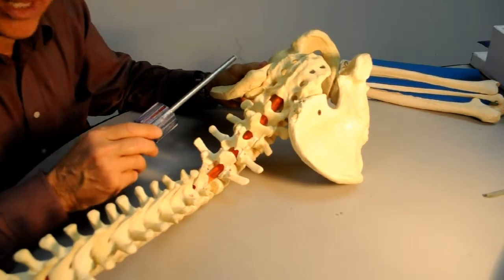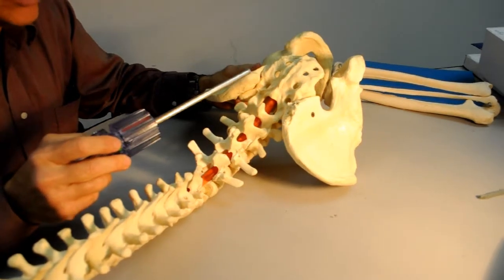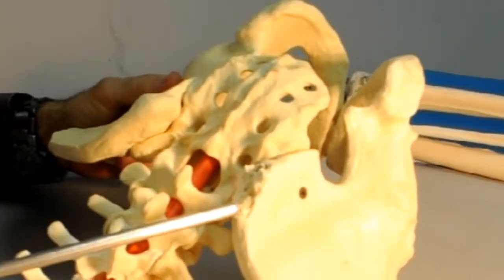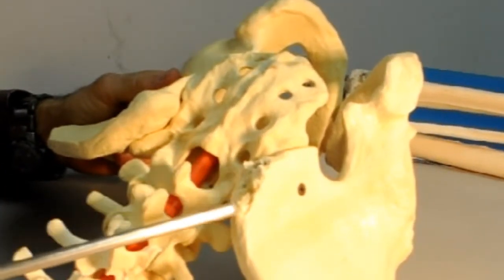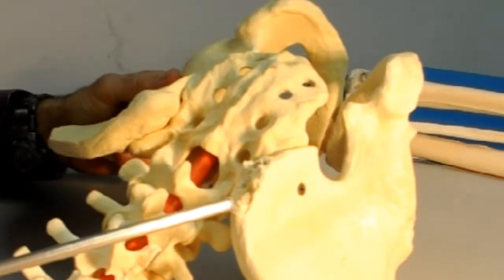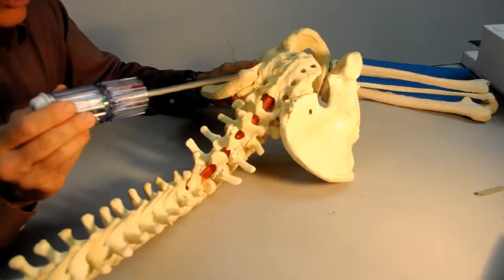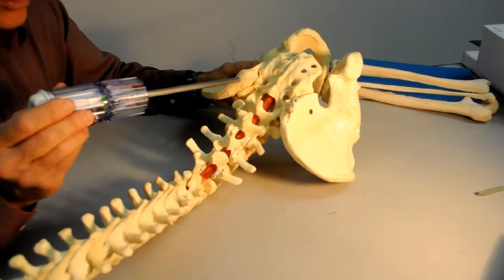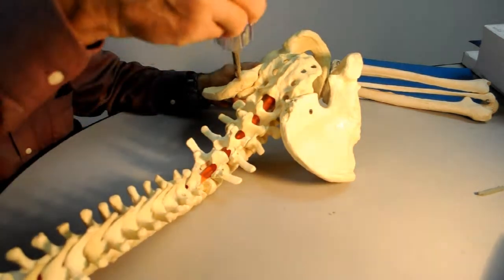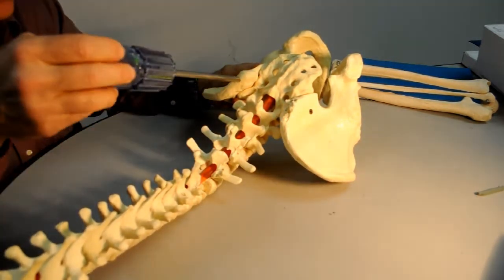For prone patients, the most probable site for harvesting bone is from the posterior superior iliac spine. You can see in this area of our saw bones, we've denuded the cortical bone generously. One doesn't need this much cortical removal to introduce the harvester. One would make a small cortical defect in the upper portion of the posterior iliac crest, and the harvester would then be introduced at varying angles through that cortical defect to harvest bone.